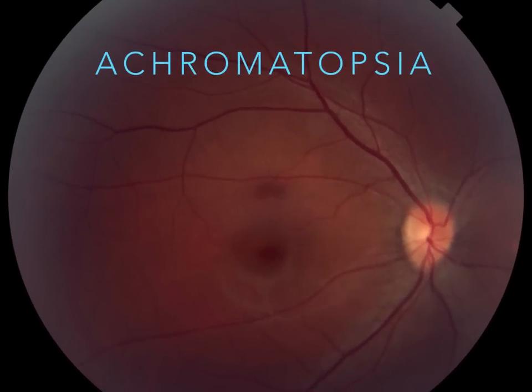So what I want to point out is that cone dystrophies might look similar on the ERG, but if they have nystagmus, obviously you don't just judge this by an ERG, and it's very likely a cone dystrophy would look different than this anyway on ERG. What I want to point out, if you could see this, and I'll actually bother to get the pointer out for this, this is obviously the fovea. What did we say? 3 millimeters temporal to the temporal margin of the disc and 0.8 millimeters below that, right?